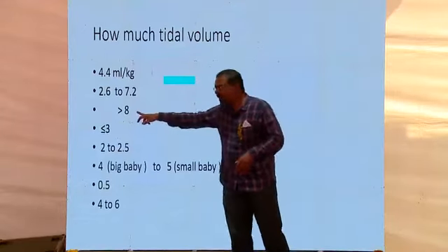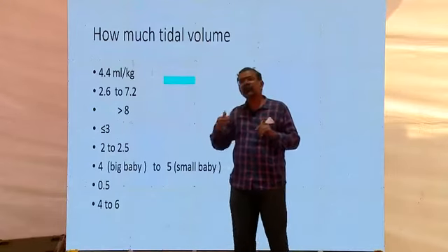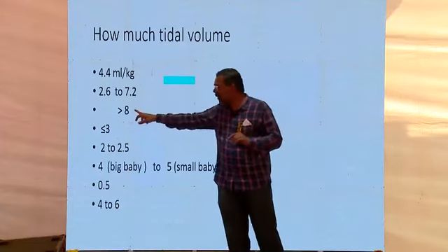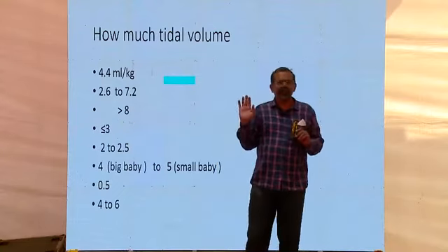So more than 8 you practice very rarely, only in those conditions where we ventilate for 1 month, 2 months, 3 months, chronic lung disease. Otherwise, try to keep the volume in cc per kg less than 8. Don't go below 3.